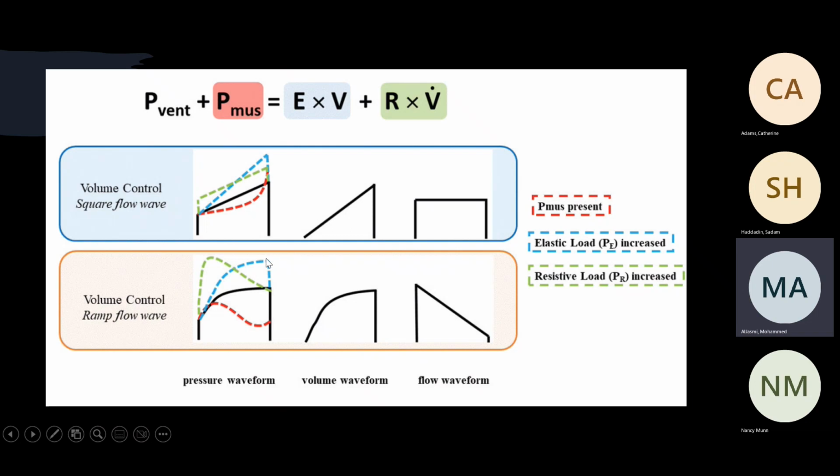If it's the same here, it starts low and then ends high. That goes with compliance. Can I know that every one that you show me, I will be 100% right? No, but it gives you a clue. You will look at the flow, inspiratory and expiratory, to know more. If there's a small airway obstruction versus a large airway obstruction, it can give you different patterns. If it's a large airway obstruction, usually you will see early resistance from the beginning. If it's a small airway obstruction, it will be late resistance.